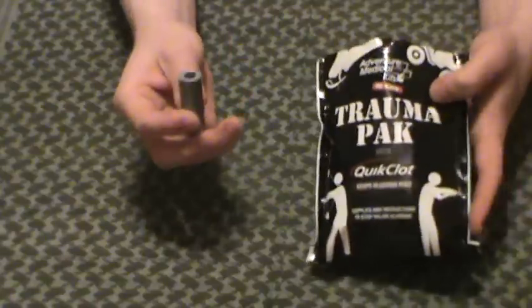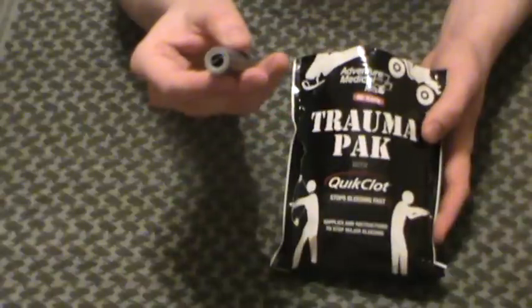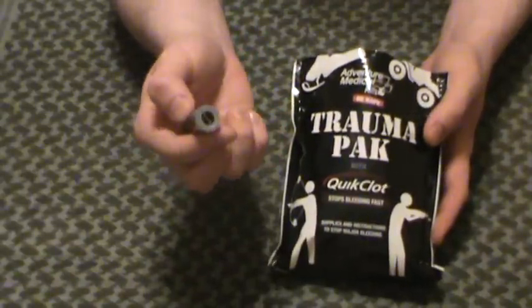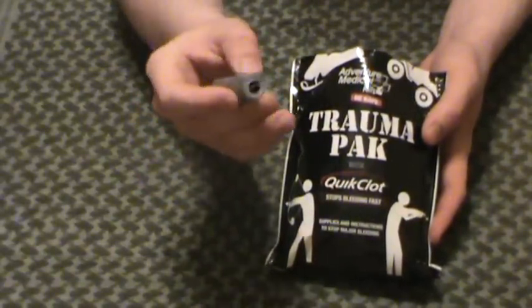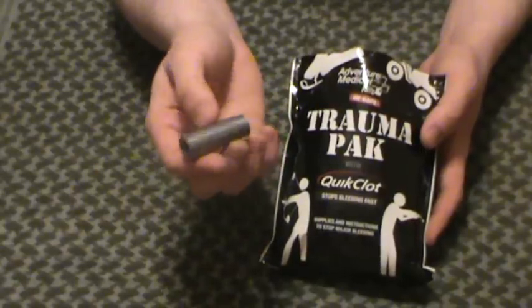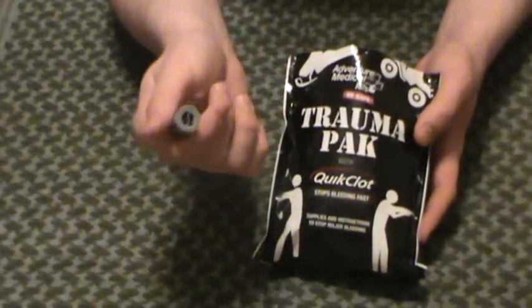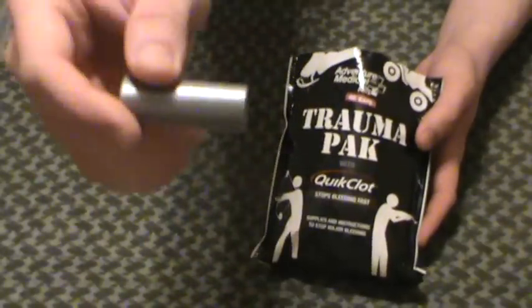Pull it apart. Duct tape. Decent, generous roll of duct tape. This is the best adhesive in the world for holding bandages and compression bandages, anything heavy that's going to be taking a lot of wear out in the wild. You need duct tape. Screw the little medical tape. This stuff is going to be good if it's wet, if it's raining, if it's cold, whatever. Duct tape holds the world together.